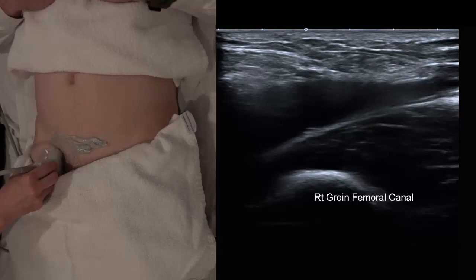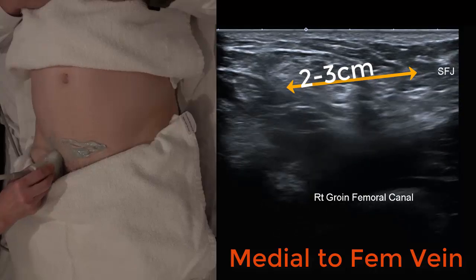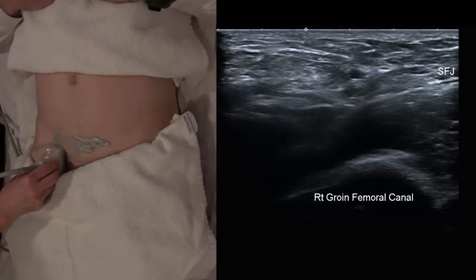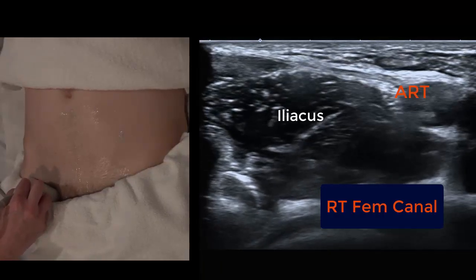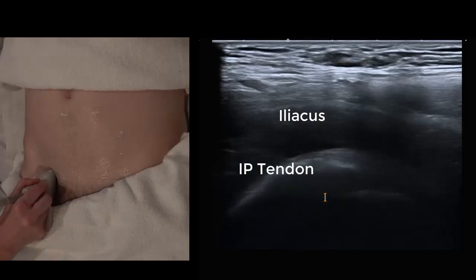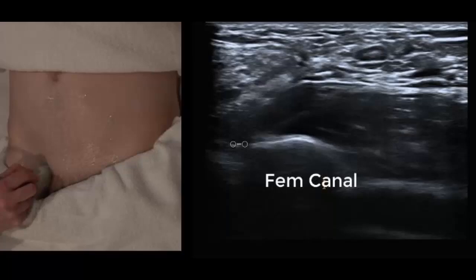If a hernia extends down to the level of the SFJ then it's probably a clinically significant hernia. The landmarks are: the inguinal ligament — we're looking deep to the ligament. We want to see something extend down below the pelvic brim. In transverse, find the iliacus, the femoral artery and the femoral head on the groin crease. Turn into longitudinal — if you're too lateral you see iliopsoas. Move past the femoral vessels and land on the femoral canal, looking superficial to the pectineus muscle.